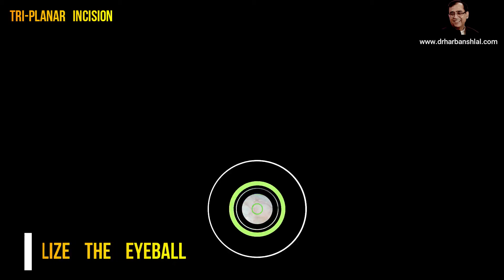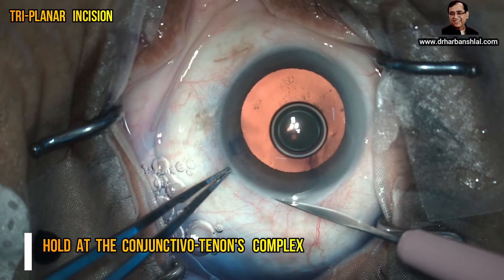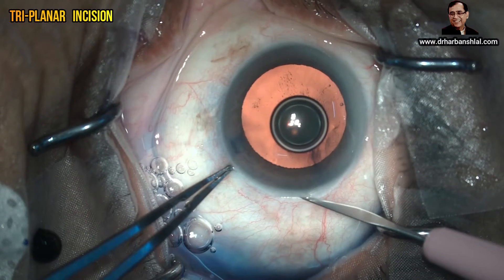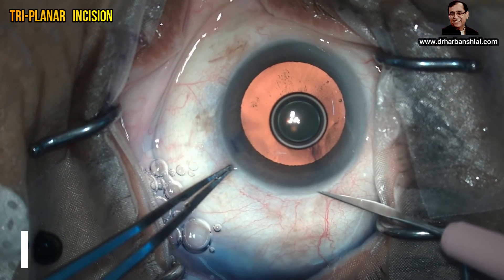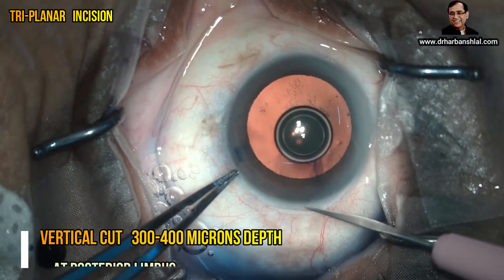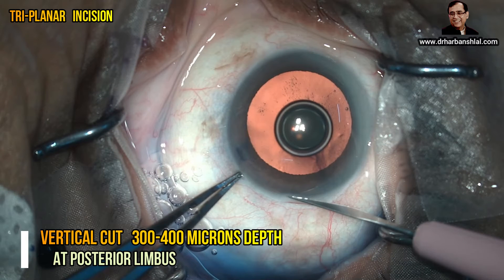Whenever you want to put a PMMA IOL or do SICS, you should make a triplanar incision. Now watch the video. Stabilize the eyeball by holding the conjunctivo-tenon's complex at the limbus, then take a sharp 15-degree blade and make a perpendicular straight cut at the posterior limbus.